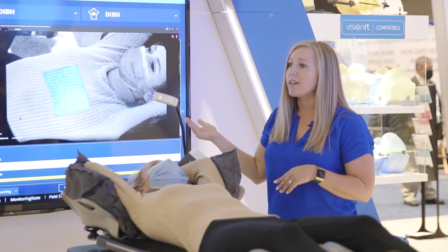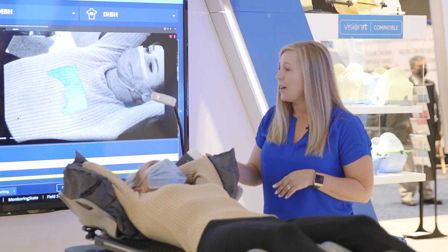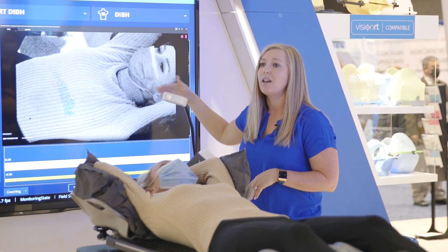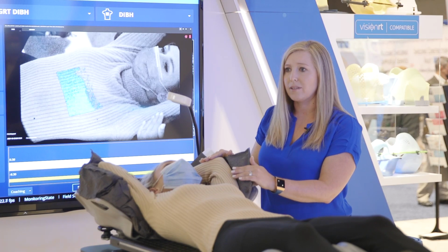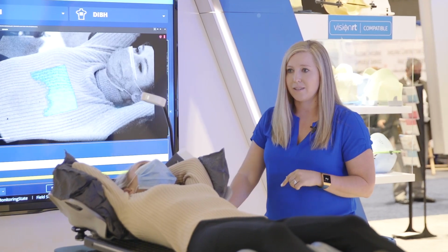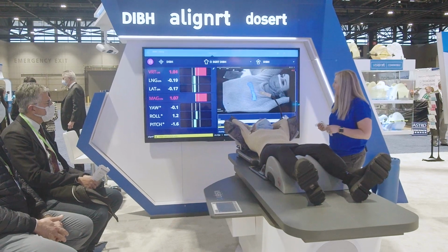This is great for any kind of error that may occur after we leave the room and get the patient set up. So if a chin were to come down into the treatment field, we would be able to see it in real time, stop the beam, go in and make that adjustment. Maybe we have an arm that didn't get put up in the proper position, but we still have a little tissue in the field, fix it right away. See it on the contralateral breast, we can fix that. Maybe we need to pull some MLCs in because sometimes you can't see that on films, right?